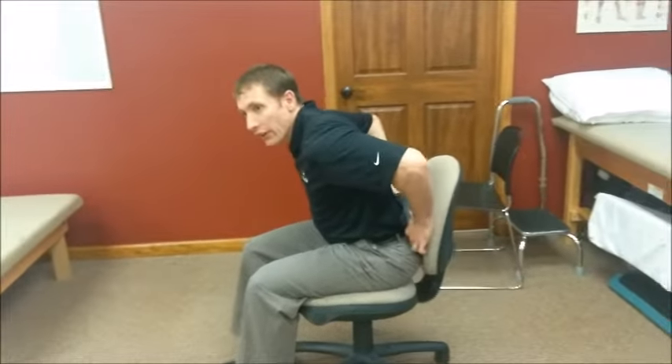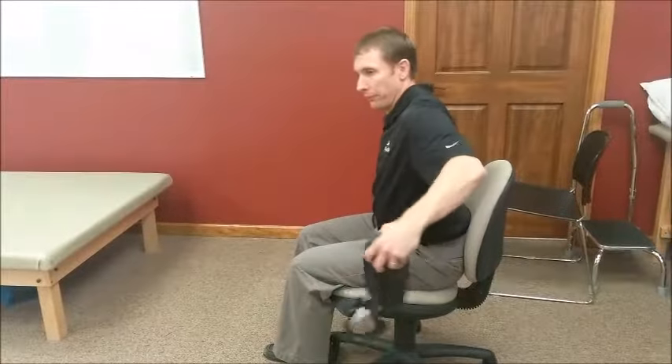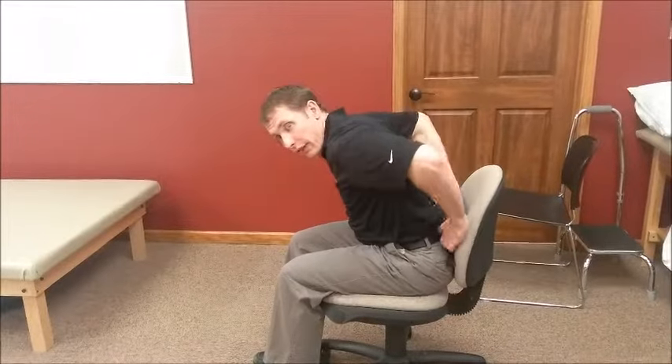What we commonly see is that people put it way too high because it kind of feels good, or they'll put it down here where it goes but then they do this. So three steps basically: hips and butt all the way back, put the pillow in the small of your back, and then sit back into it. That's it.